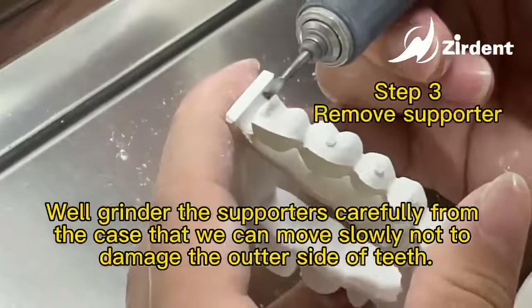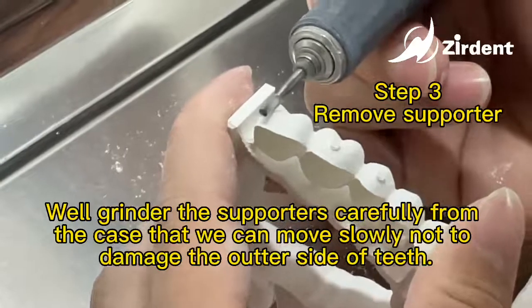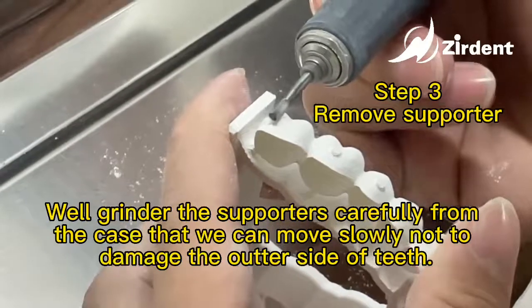Grind the supporters carefully from the case, moving slowly so as not to damage the outer side of the teeth. Thank you.